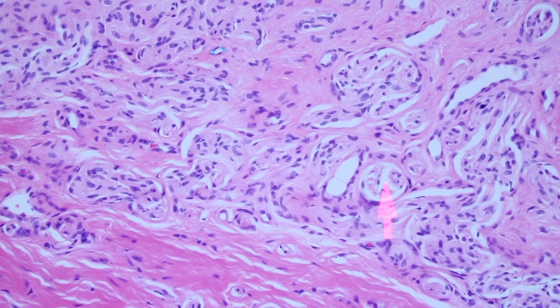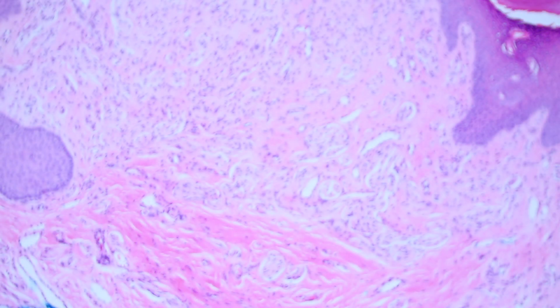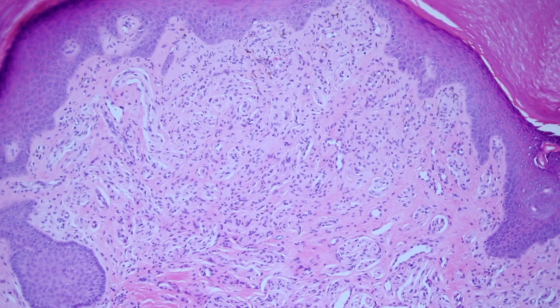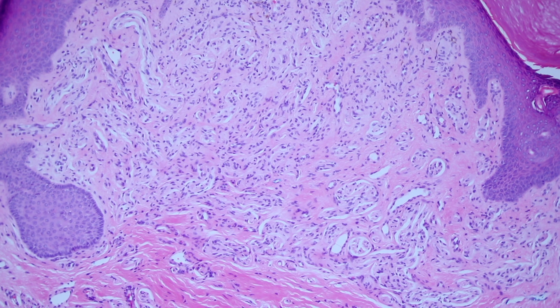Look — here's a nerve bundle, here's a nerve bundle, here's another one. There's a bunch of nerve bundles all together. When you have a bunch of nerve bundles in one place, we often refer to that as a neuroma. There are several different types of neuromas. You might think this could be a traumatic neuroma — if you get a surgery or injury, sometimes the nerves will try to regrow and tangle together and make a little collection like this, and we say that they're a neuroma.